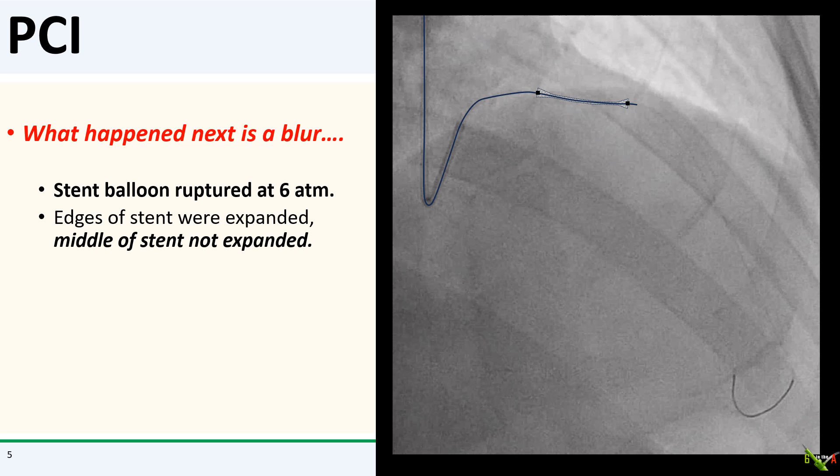What happened next is a blur. The stent delivery balloon ruptured at around 6 atmospheres, which was really odd — the LAD did not look particularly calcified. This left the stent only partially deployed, like a dog bone. The proximal and distal edges of the stent were expanded, but the middle of the stent was not. I didn't think this was a big problem at first. The stent was still on the wire, so I just needed to pull out the ruptured balloon and pass another balloon to complete the stent deployment.